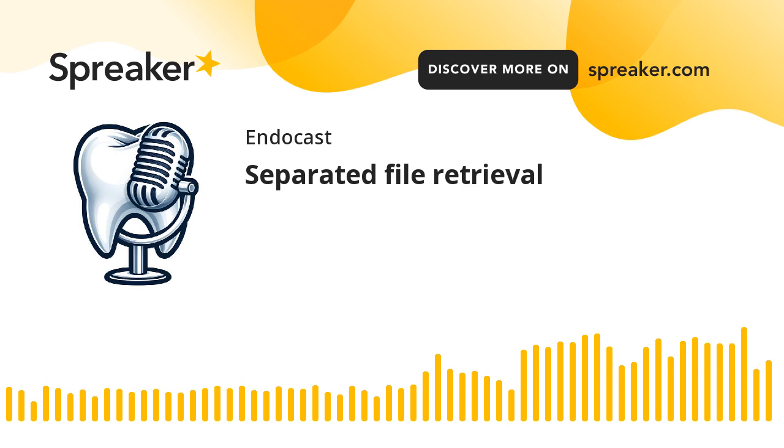The other technique is using the wire loop. Simply, it's like a cowboy. We know the cowboy has a rope with a lasso. Yeah, the lasso. Exactly. He throws it on a cow or anything, and then tightens the loop around the neck. This way, it gets grasped. The same way we're doing with the file.